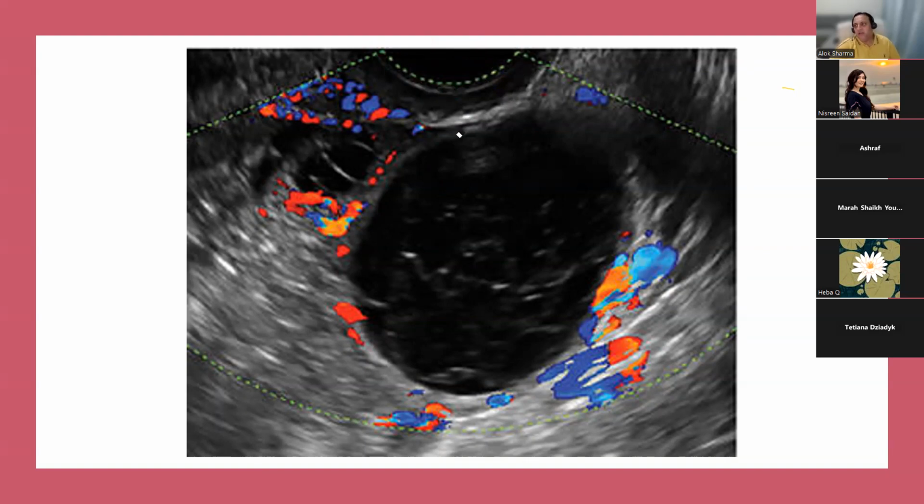But then you enter into tissue versus fluid. Now, the acoustic impedance, the difference between when it enters lipid versus the wall to going into fluid, we know the density of fluid is much lower than that of the cyst wall. So the difference in acoustic impedance is not that high. So this looks less bright, the inner part of the cyst wall.